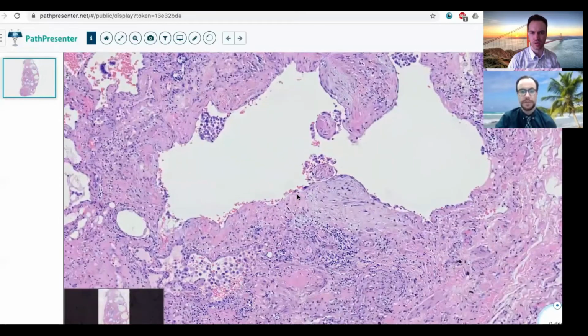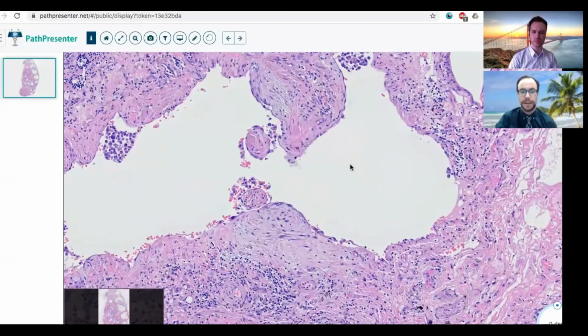If you zoom in here and just hold your screen there, I think I can actually annotate these for you. Okay. So I think there's a nice fibroblastic focus right there. And then there's a nice fibroblastic focus over here as well. You can see it's kind of this loose proliferation of fibroblasts that have a paler appearance on the H&E. Yeah. And I reviewed the images that you submitted as part of the Google document, and you're exactly right in terms of areas of fibroblastic foci.